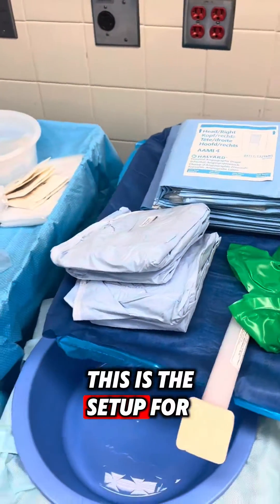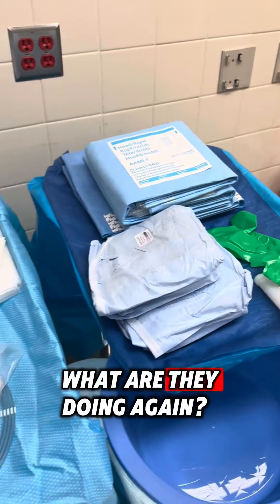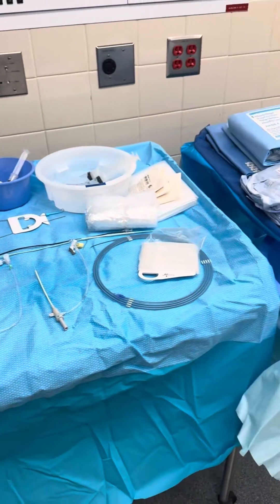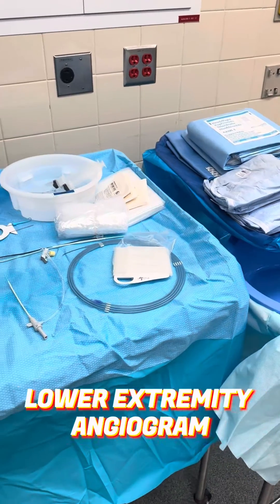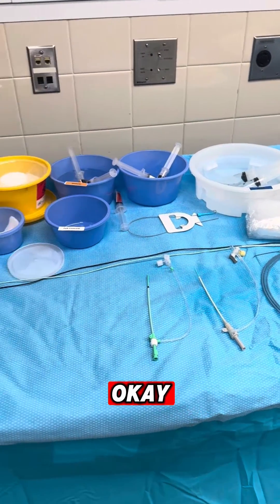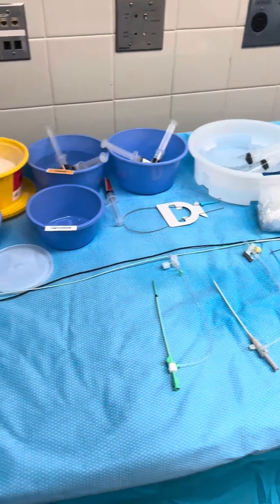This is the setup for a vascular procedure — a lower extremity angiogram with possible intervention including balloon angioplasty and stent placement. Lower extremity angiogram.